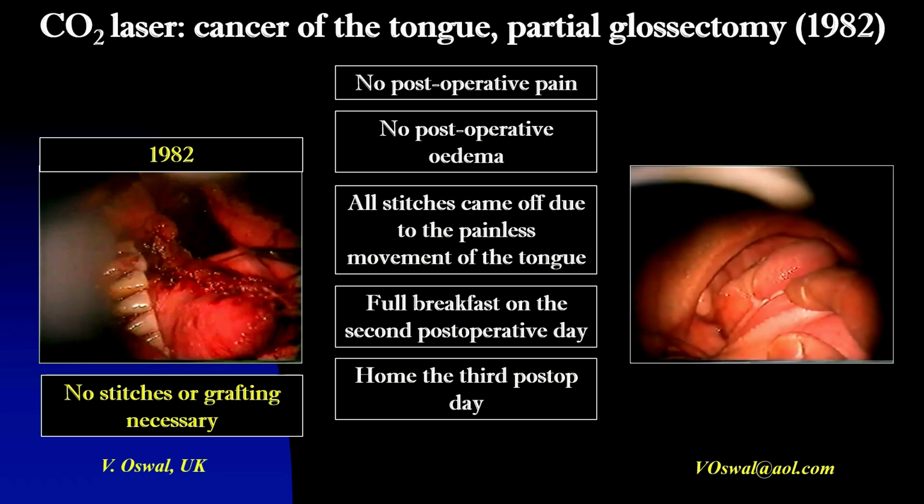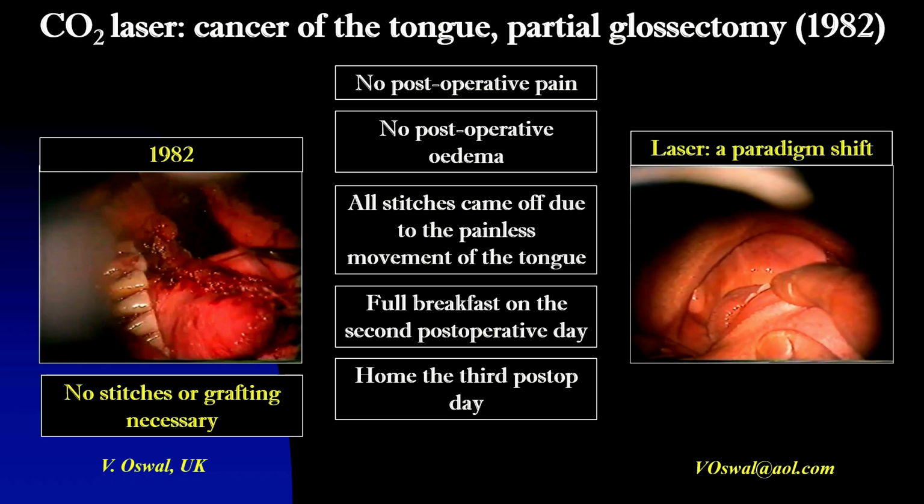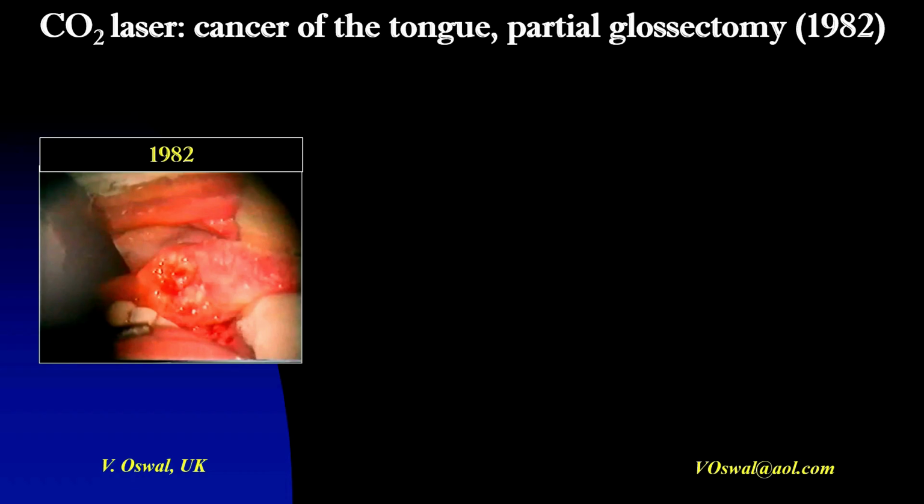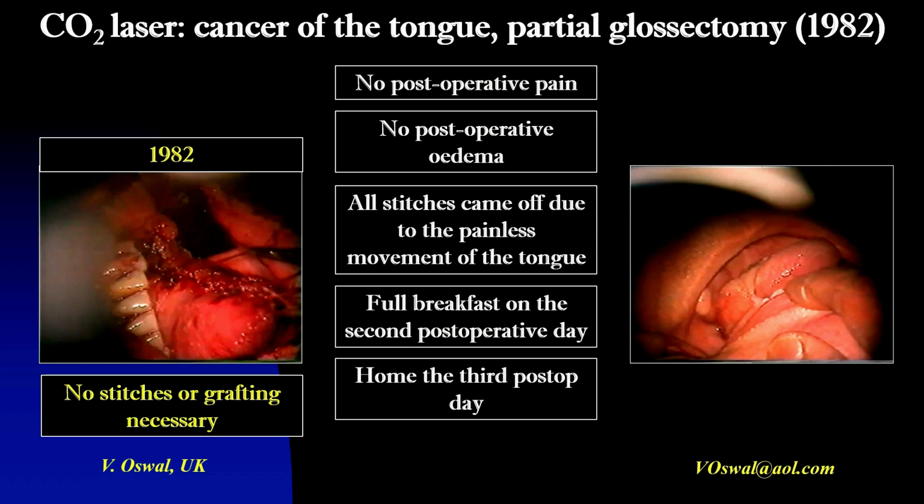A 6 weeks review showed full recovery. There was very little fibrosis or morbidity. The tongue mobility was remarkable considering the size of the tumor. I was witnessing a paradigm shift in the surgical instrumentation.